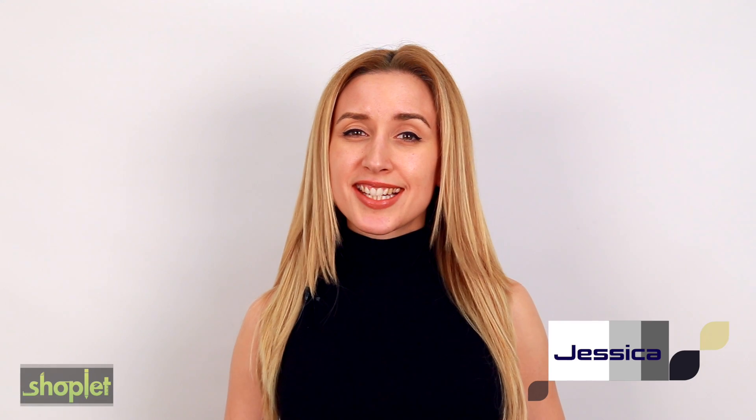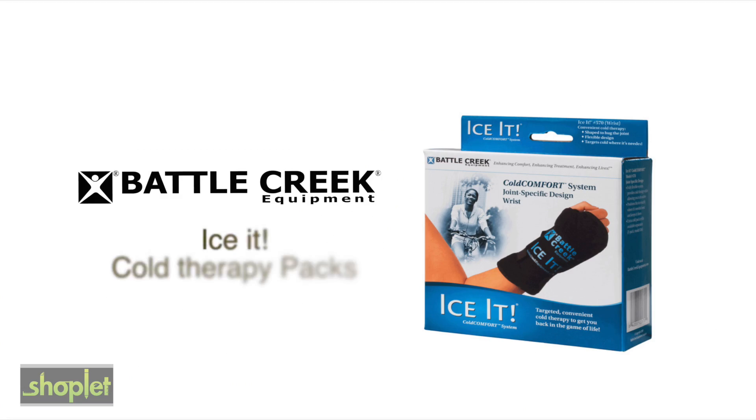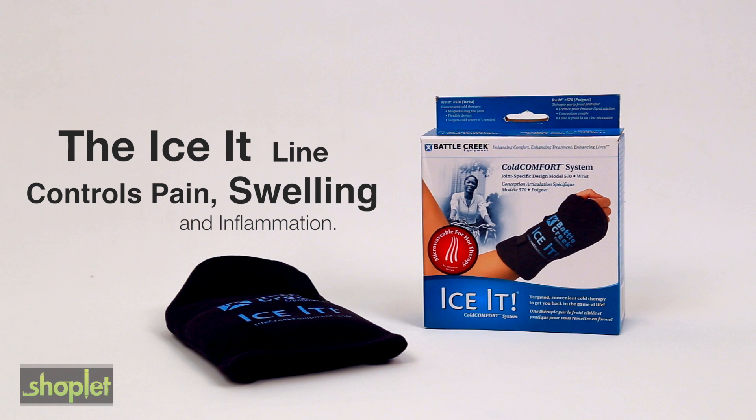Hi, I'm Jessica, and this is the Ice It line from Battle Creek. The Battle Creek Ice It line is the ideal solution for controlling pain, swelling, and inflammation.